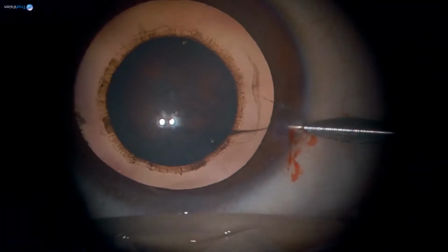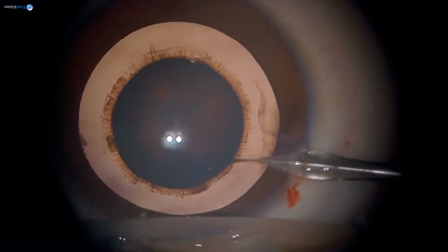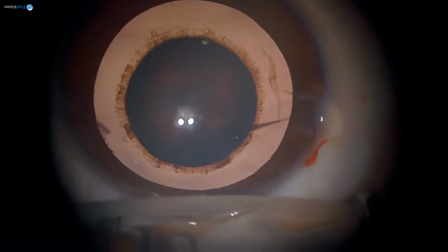So I need to make the incision a little bit bigger. Later on, you can implant the lens from the same incision if you want. So that's the advantage of that.